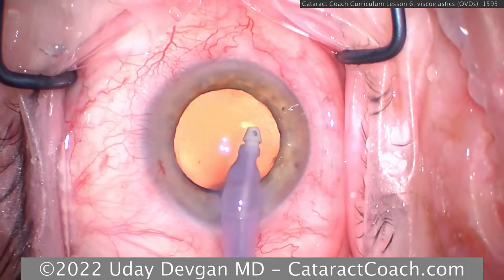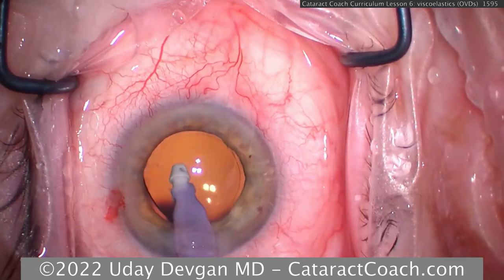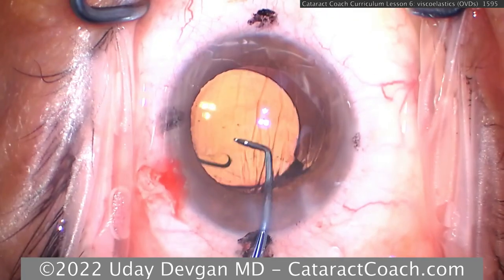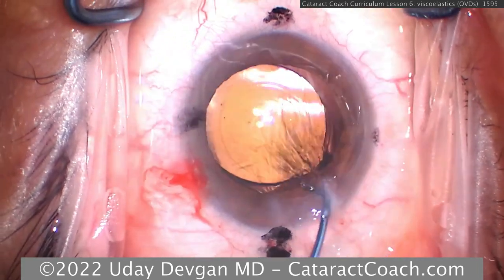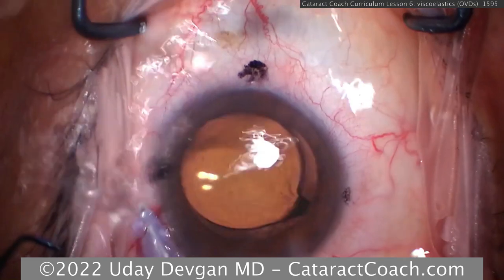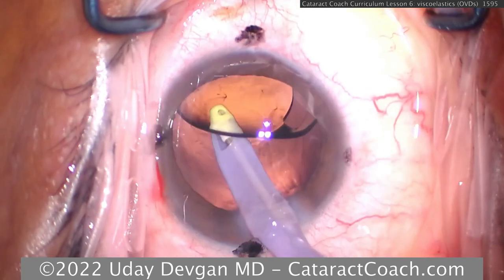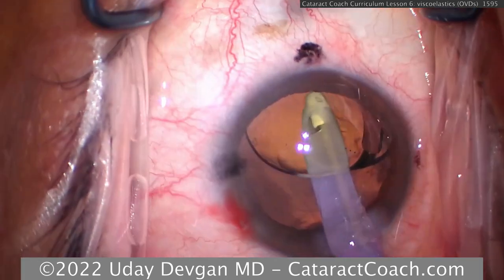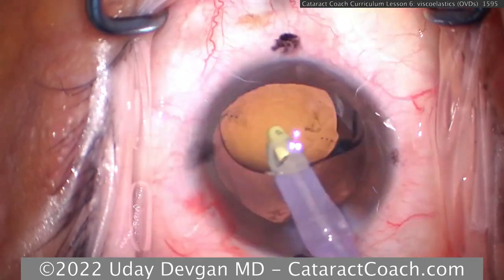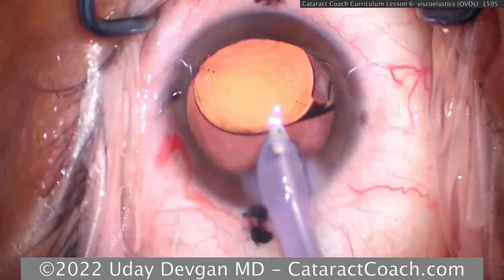There's also another issue, which is intraocular pressure. Retained viscoelastic in the eye can lead to high intraocular pressure after surgery. So we've all seen those post-op patients. They had a beautiful cataract surgery. And in the post-op period, immediately post-op day one or day three or even week one, the pressure's high. Usually after day one, two, three, the pressure's high in the eye because of retained viscoelastic. It's not from a steroid response. Remember, the IOP spike from a steroid response ends up coming at around the two-week mark after surgery or after beginning the use of topical steroids.